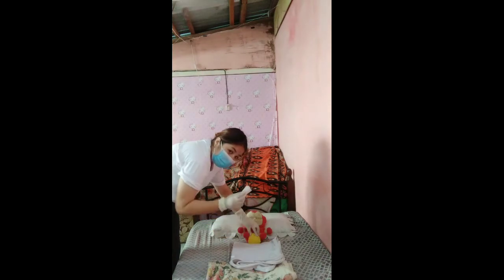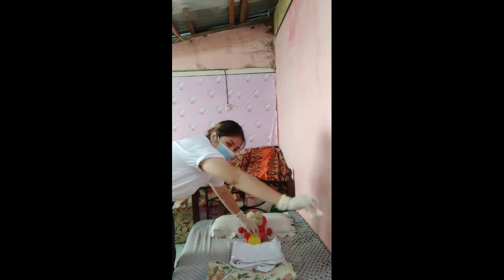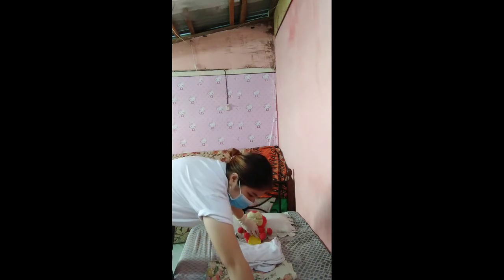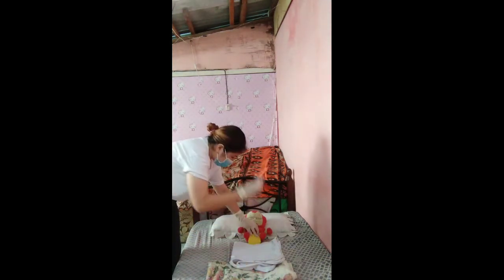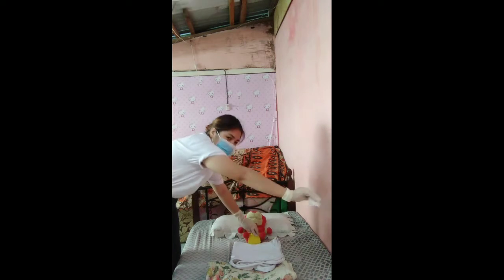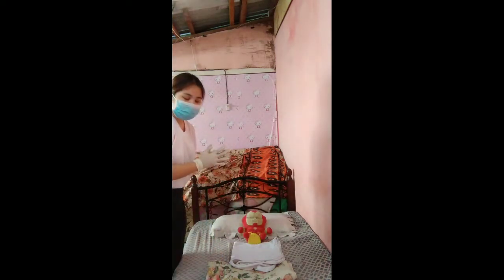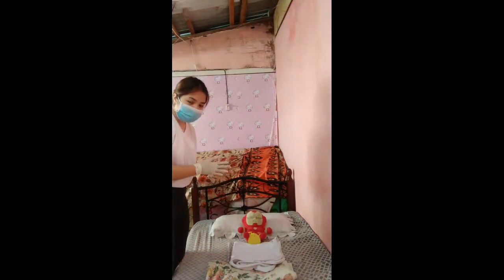So here on the left side of the vagina of the patient, to the anus, discard here, and the last one is to the center. 1, 2, discard, and we are ready to put the catheter into the urethra of the patient.